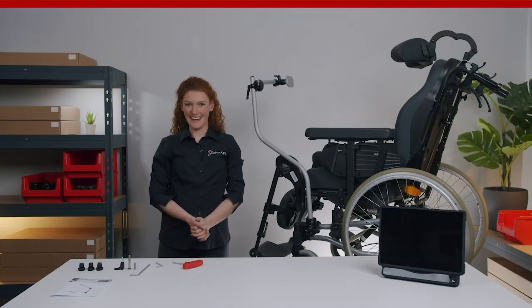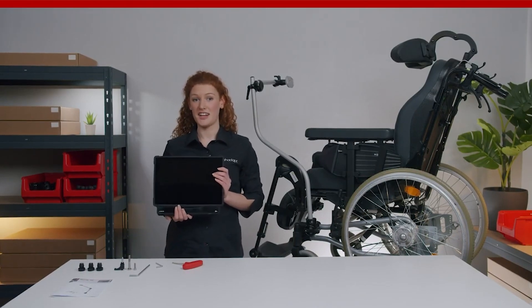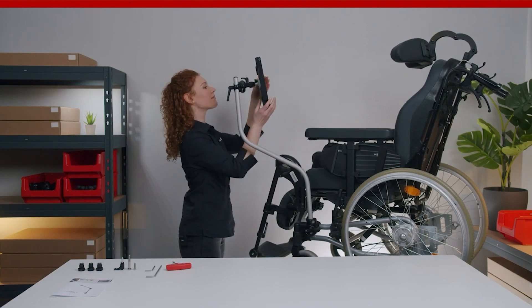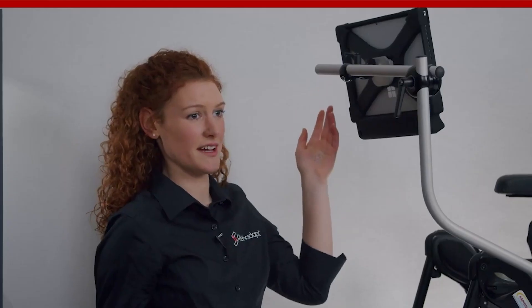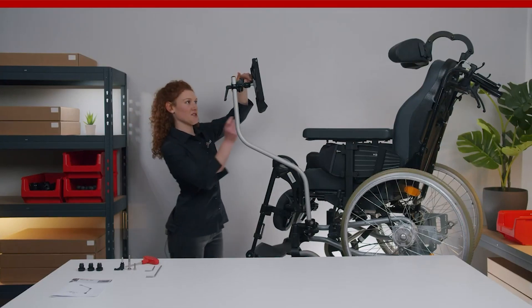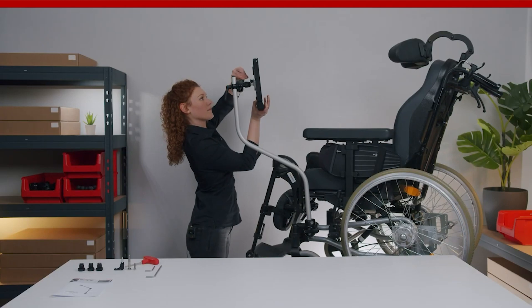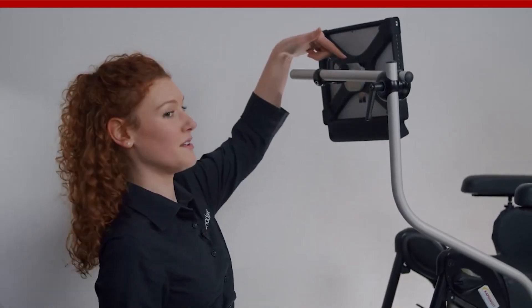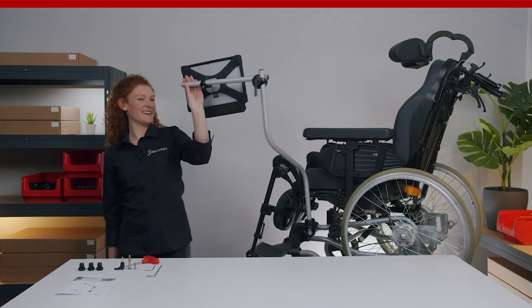Now we attach the eye gaze device. Here it's important to always support the device when adjusting its orientation. It is really important that you never adjust the ball joint without opening the quickshift lever first — otherwise you will damage the UDS. This ball joint allows you to fine-tune the orientation of the device. When you tighten it again, make sure that the lever is aligned with the UDS. And that's it — as you can see, it swings easily into the exiting and operating position.